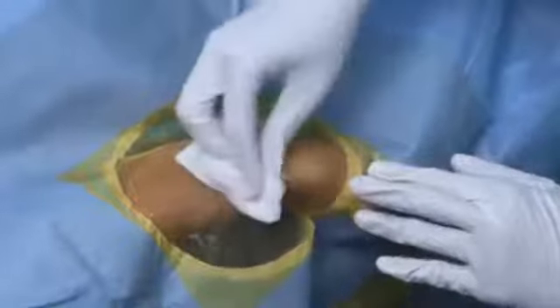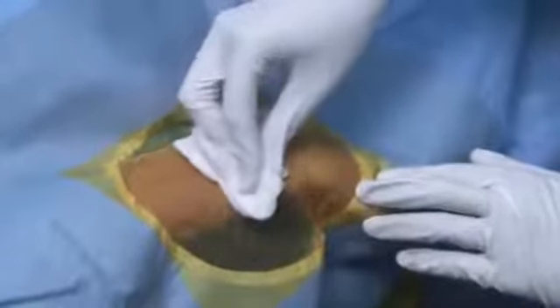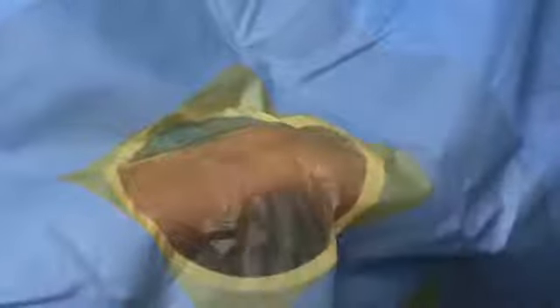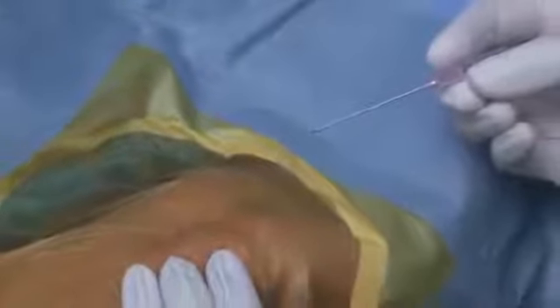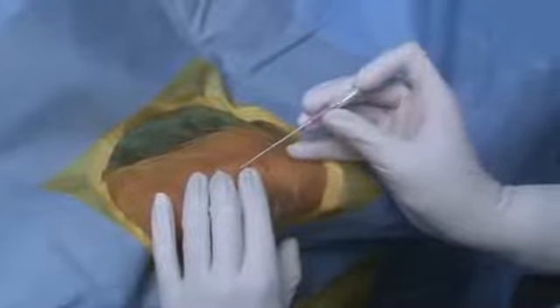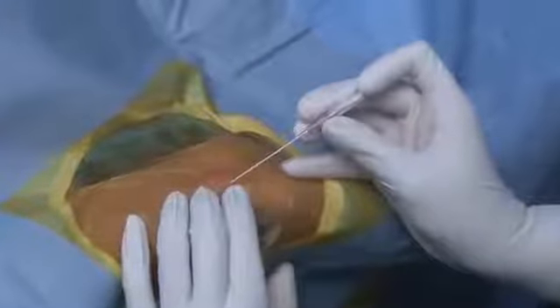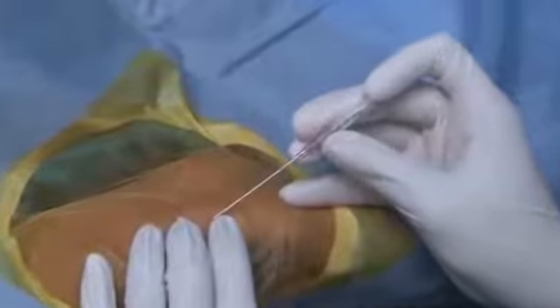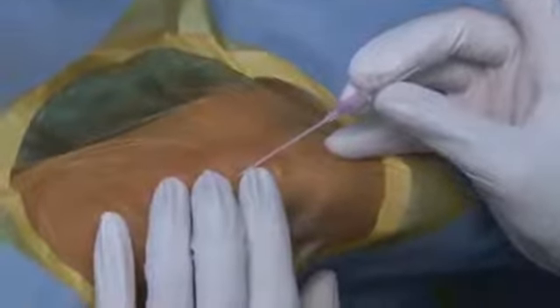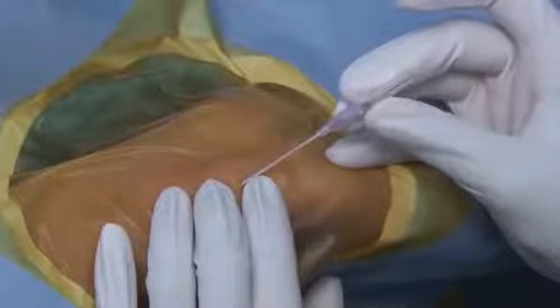We are now trying to disperse the xylocaine so that there is good local anesthesia. The radial pulse is being fixed with two fingers, and the needle is being introduced. The needle penetrates the skin.